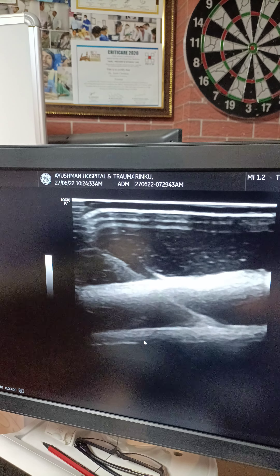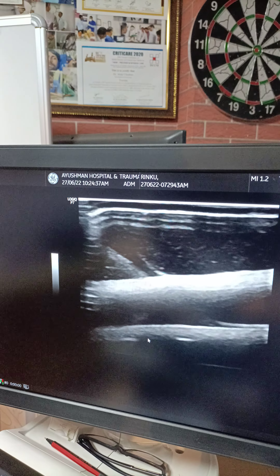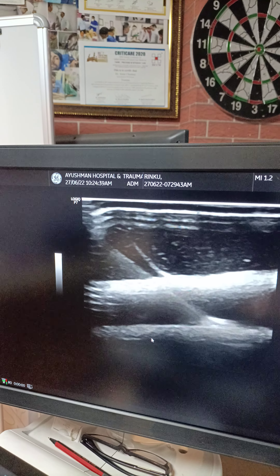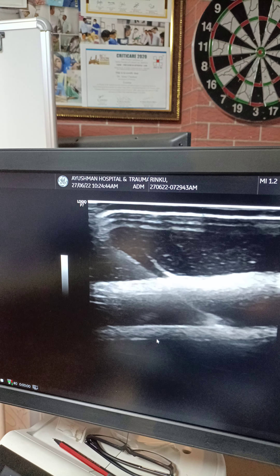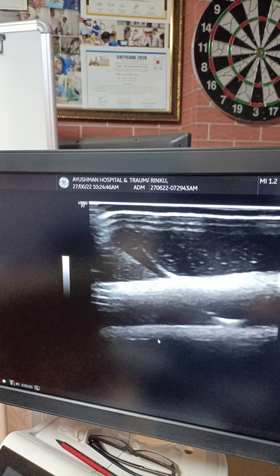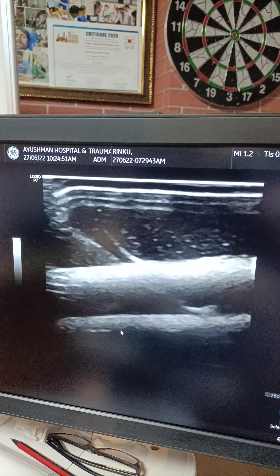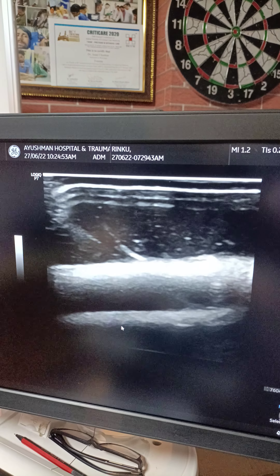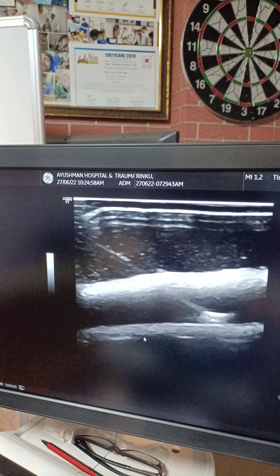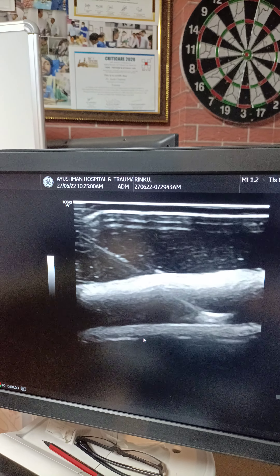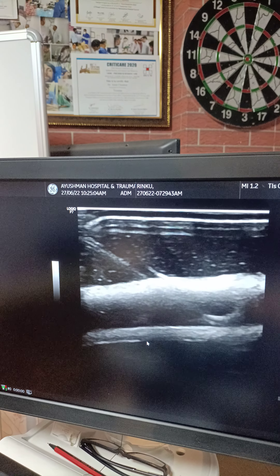This mannequin is quite low cost and the disposables are very affordable. This is the guide wire, and the rest of the steps you can simulate. I hope you find this mannequin very useful. There is a lot of concern — and rightly so — about patient safety, and when you perform ultrasound guided procedures, there is almost no chance of hitting the artery, damaging other vessels, or injuring surrounding structures. That's all for today — thanks for your time.